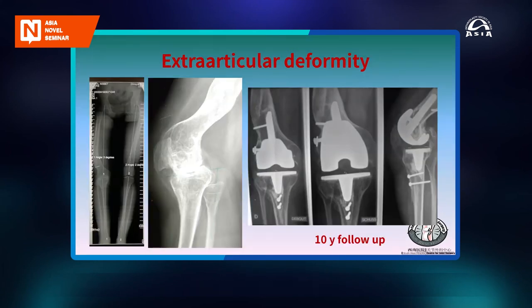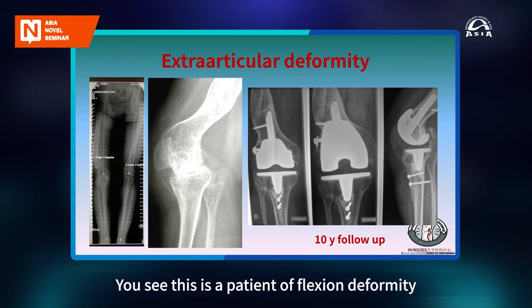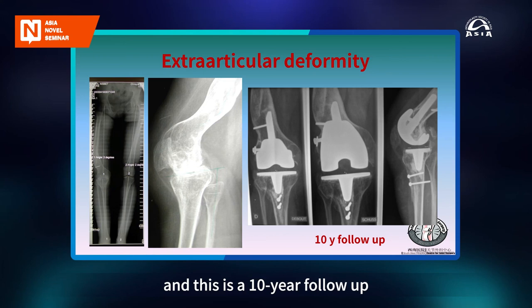surgical procedures. And this case is also from Jean-Louis Briat. You see, this is a patient with flexion deformity with extraarticular deformity. So he did not want to correct it with osteotomy. So he did soft tissue balancing and bone cuts. And this is a 10-year follow-up. The patient still has a good range of motion and very good function.